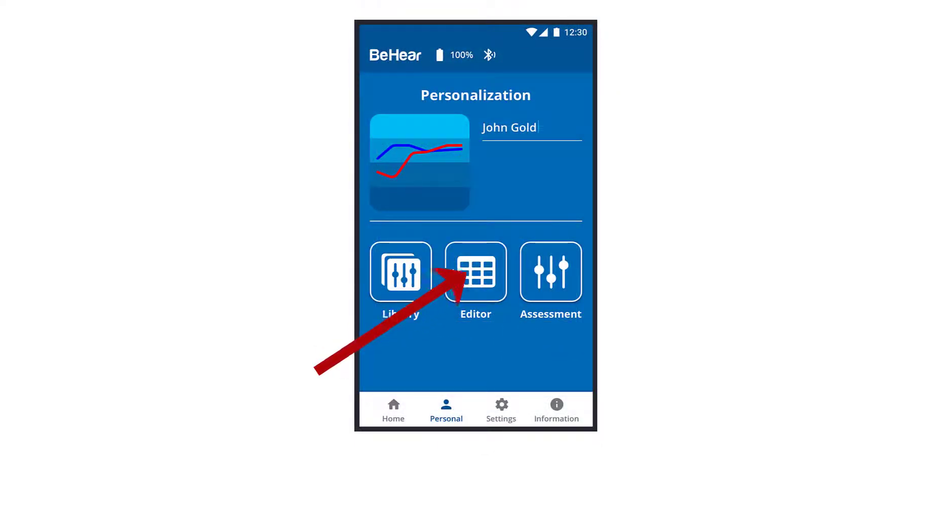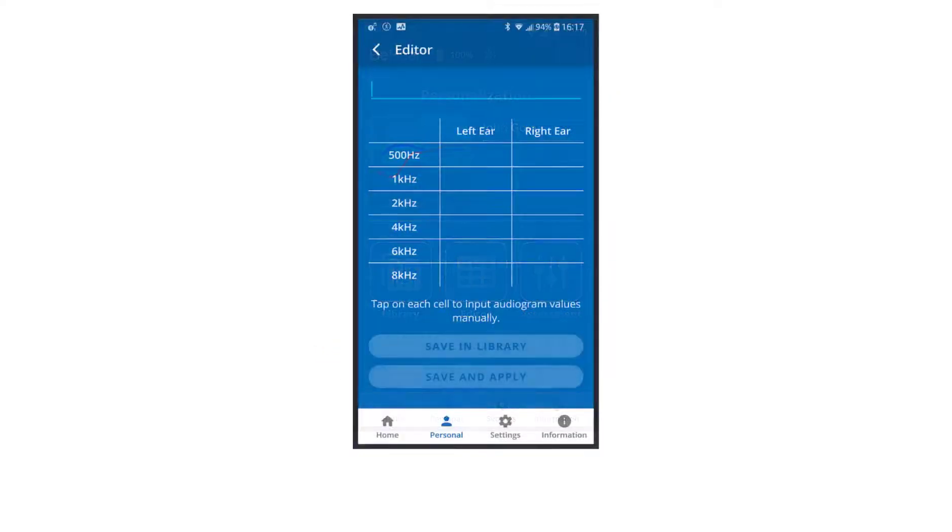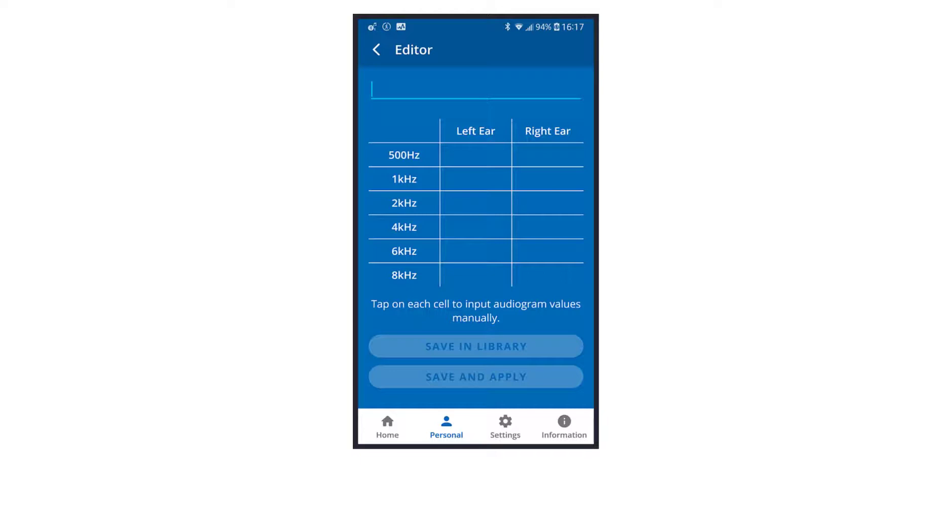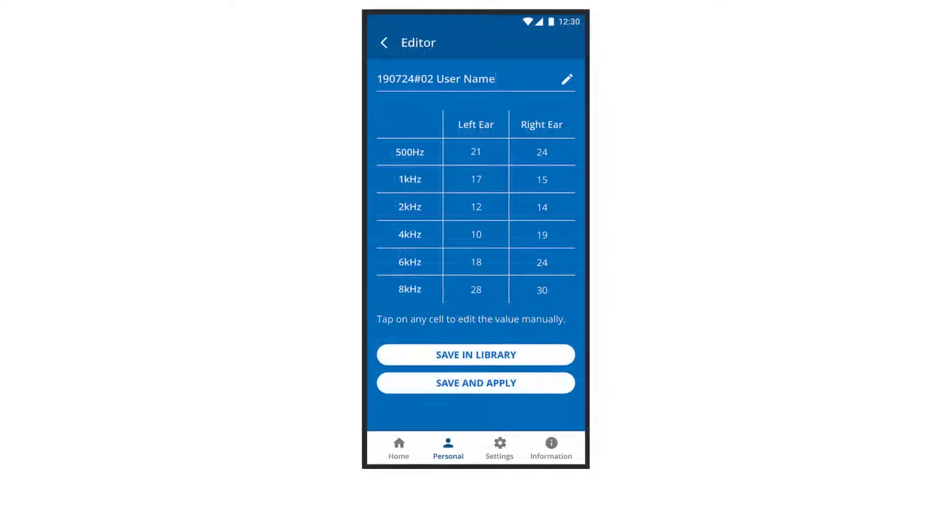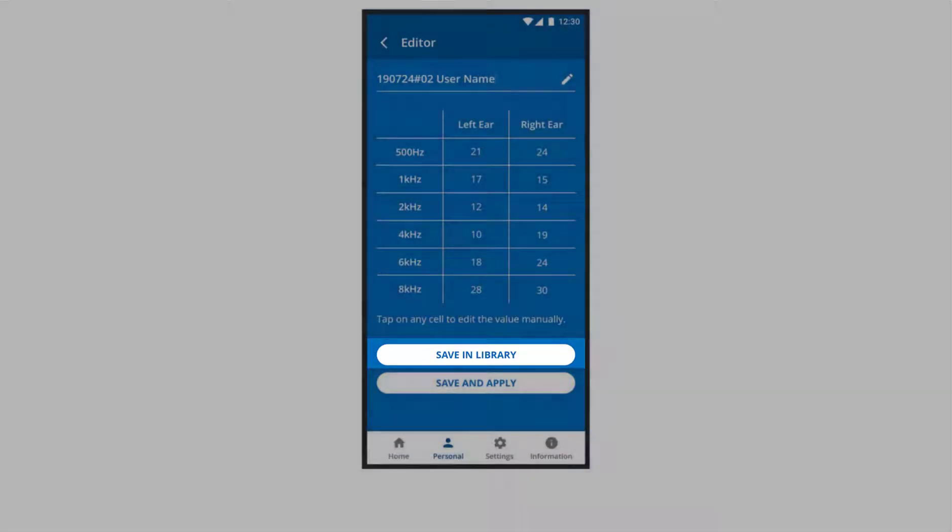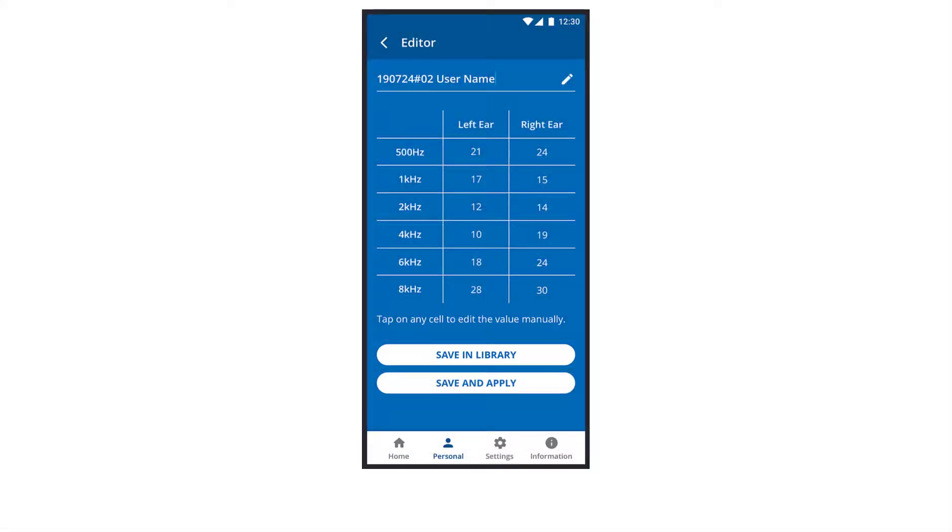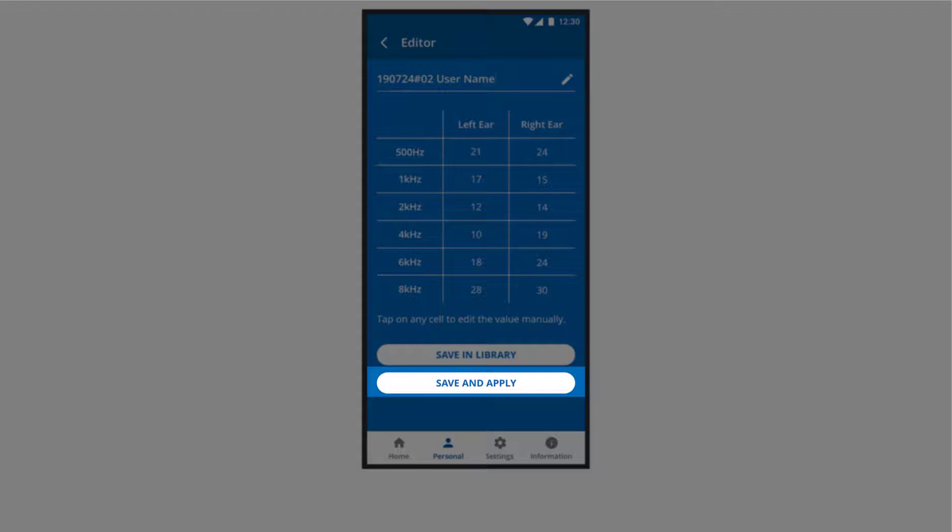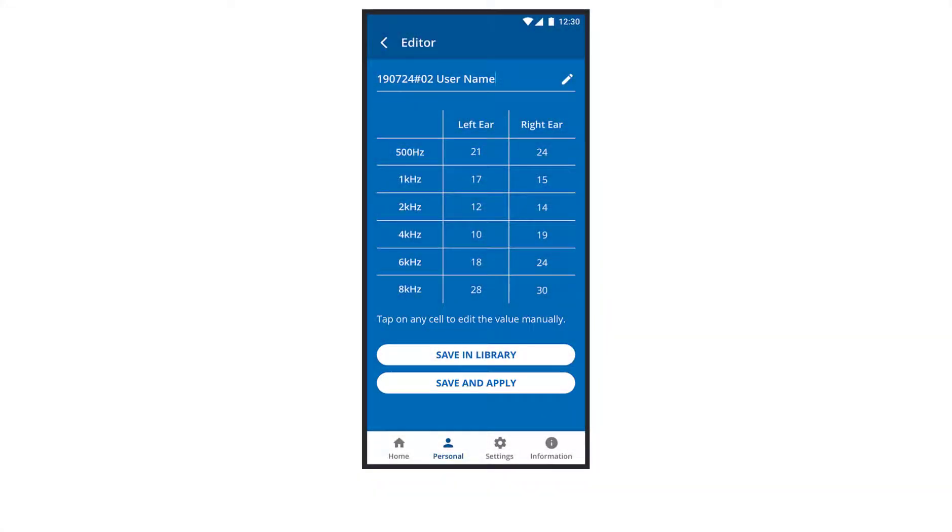Tap the icon if you have a recent audiogram and want to input the values from it directly to the headset. You can either save this audiogram in the library for later use by choosing Save in Library, or choose Save and Apply to select it as the current hearing profile. If you choose to apply the settings, you will need to reset the headset, which takes a few seconds.